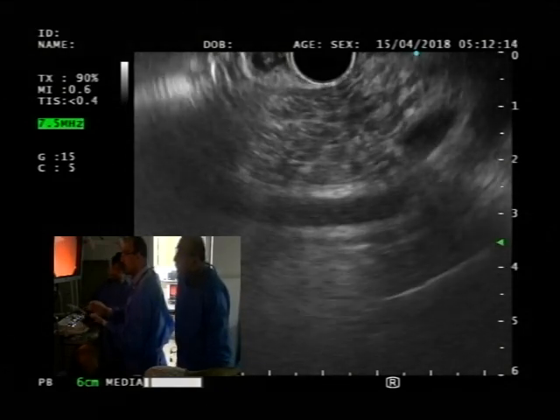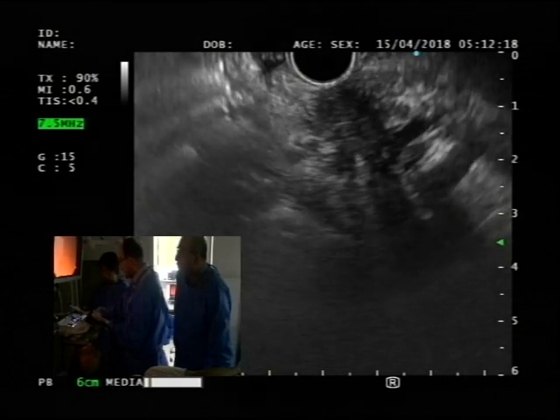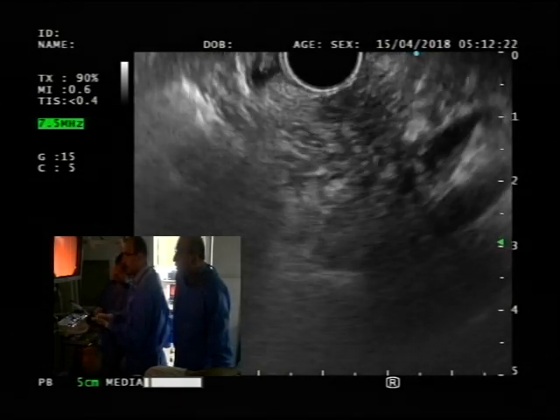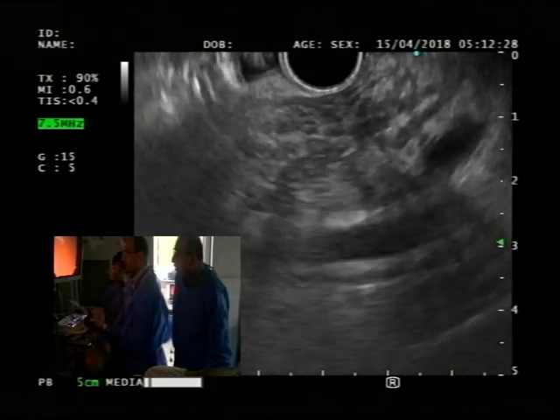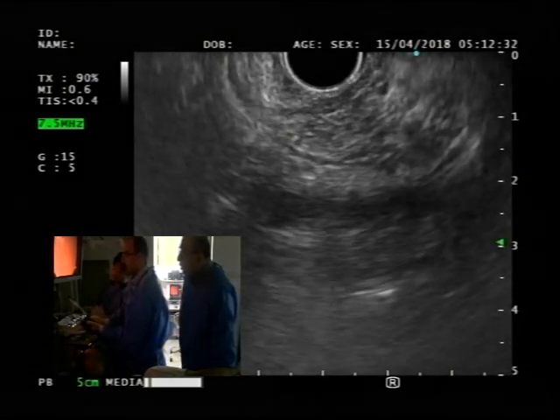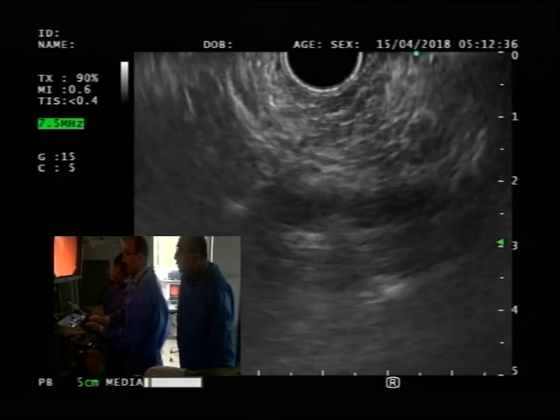And then I'm going to look for my needle tip. So here I tend to actually magnify more just to get closer to see my needle. Right now I don't see my needle. I see some movement at the right upper corner, but I actually don't see the movement. So what I'm going to do is push the stylet out some more. Now I can see it shadowing with my elevator.